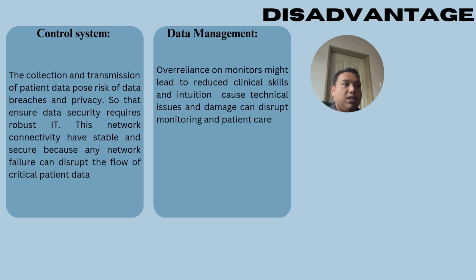For patient monitor disadvantages, first is control system. The collection and transmission of patient data pose risks of data breach and privacy, so ensuring data security requires robust IT. The network connectivity must be stable and secure because any network failure can disrupt the flow of critical patient data.